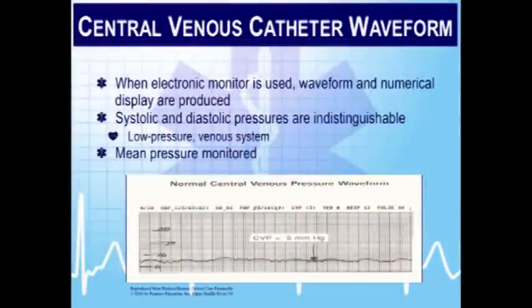We don't care about that. At your level, even at my level, most people don't care about knowing all of that, the detail of it. Suffice it to say, though, I don't want to see a straight line going across the screen. I want to see these little undulations because there is mechanical activity happening very close to the tip of that catheter that I expect to see some little fluctuations in it. When I'm monitoring CVP, the monitor knows to just display the mean value of that waveform. Okay?